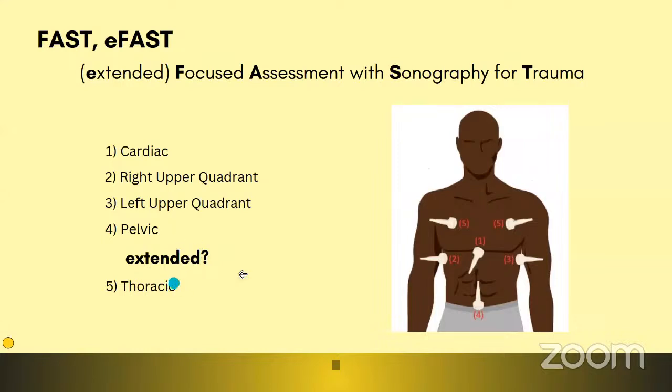In the thoracic cavity, we have the pleural space. All these spaces can potentially collect free fluids in case of trauma or hemodynamic instability, as in effusion or cardiac tamponade. And trauma means we would mostly encounter blood or chyle.